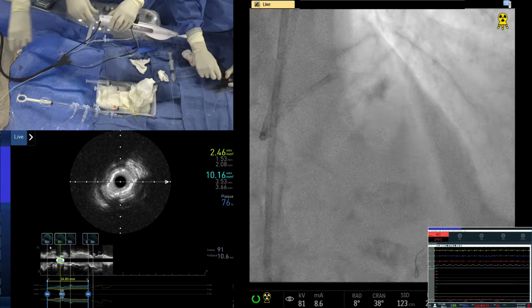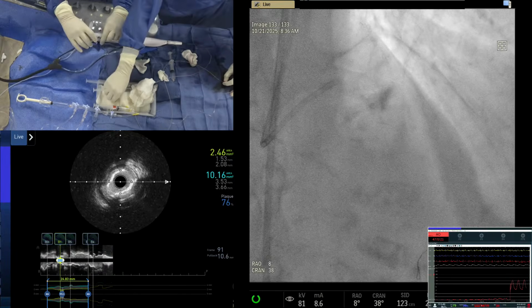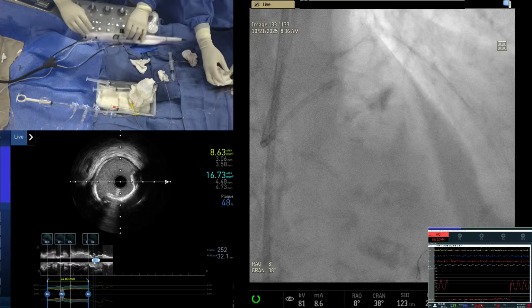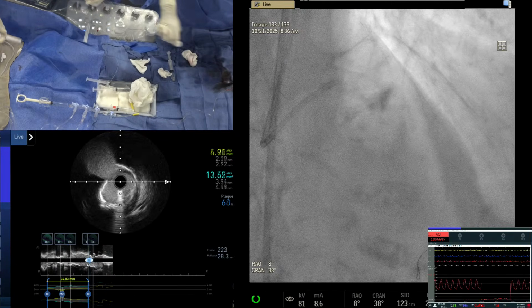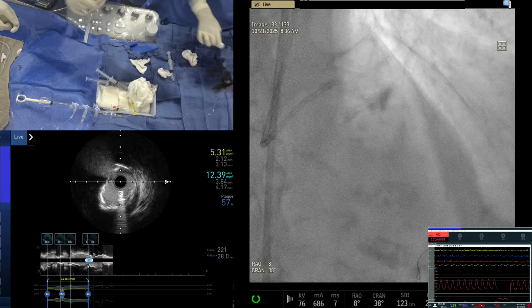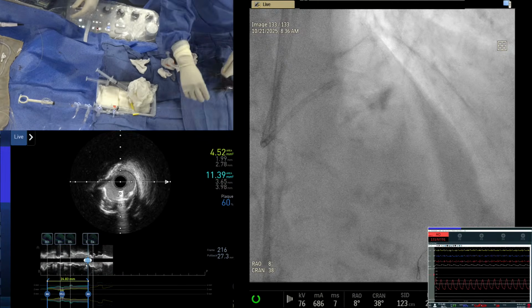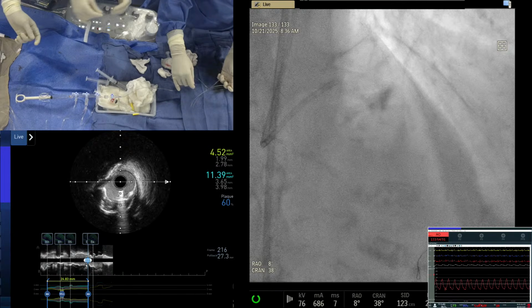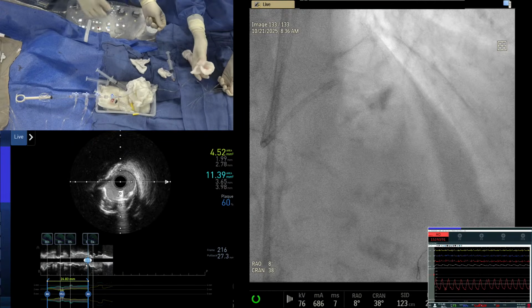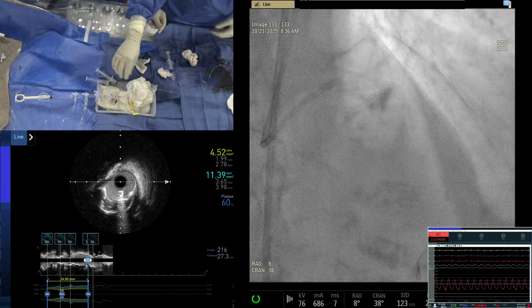So let's image the diagonal. We don't take the clip out till we come out. The wire starts spinning otherwise. It has to be once the burr is out, then only you take the clip out. Samin, you made that statement to the fellow? Yes. Excellent. They were very ready to come out, they thought the wire had come out, but no. The burr has to come out before, otherwise the wire will spin. Right, it's holding the wire in position.